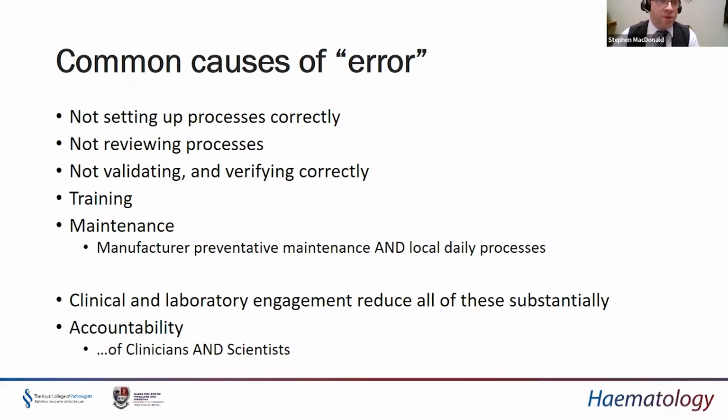Even more so than particularly when I first started is the importance of maintenance and preventative maintenance and corrective maintenance on highly automated analyzers. The reason that that is more prominent now than it was when I started was that there's more analyzers. When I started, we used to do a lot of tests manually. So maintaining the equipment was maintaining the person. But now we have highly automated analyzers for some techniques, and we can't just plug in and play and add a sample to an analyzer and hope that it works well.